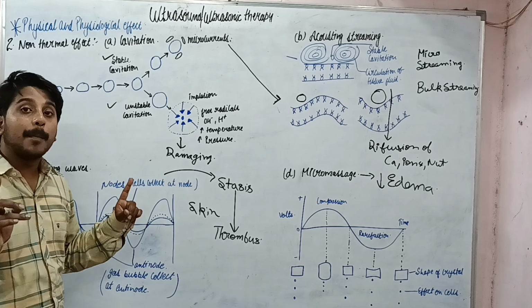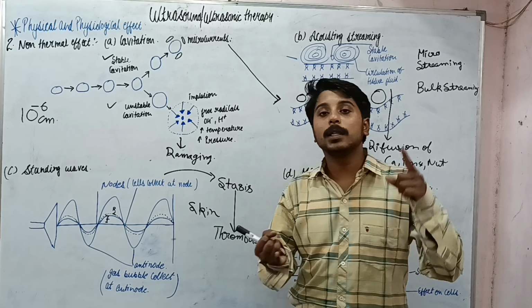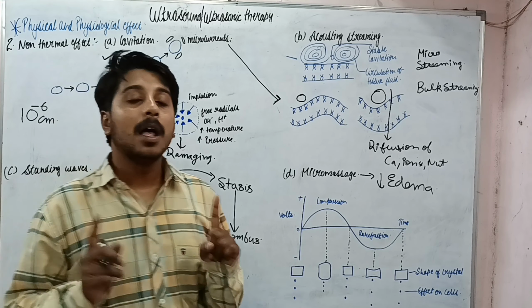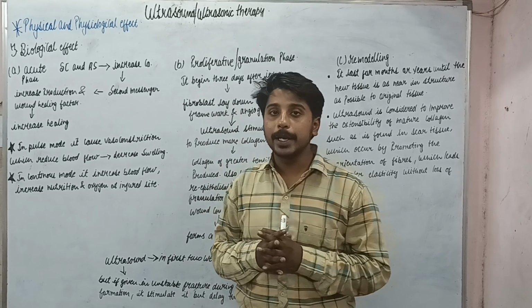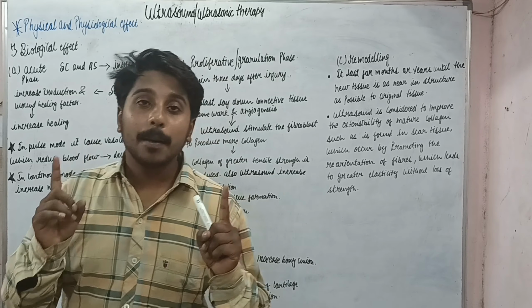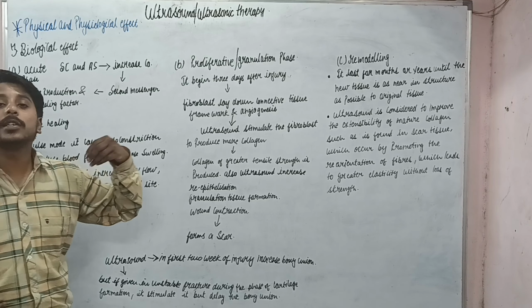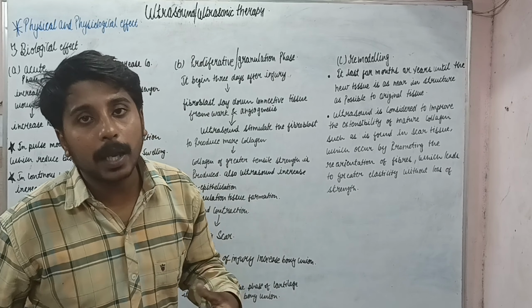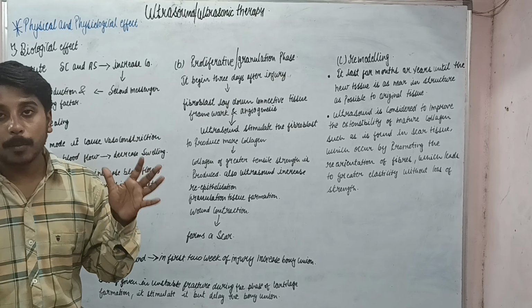Okay, so this is about the non-thermal effects. Till now we have completed the thermal and non-thermal effects. Now we are moving toward the biological effects of ultrasound. Now we are going to study the biological effects. These are the effects related to the biological process of healing, that is, the effect on the overall healing process.